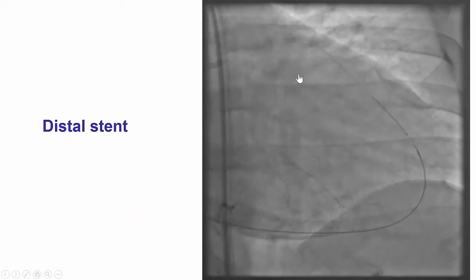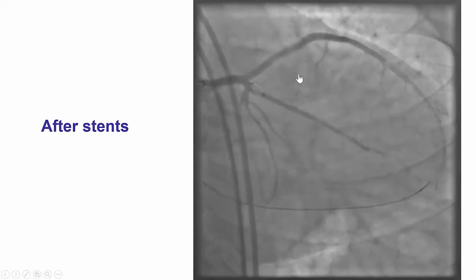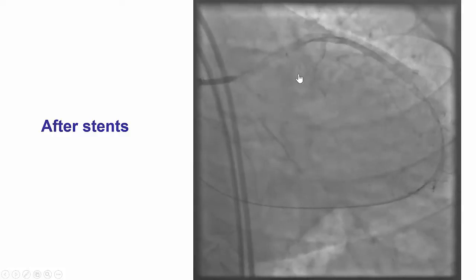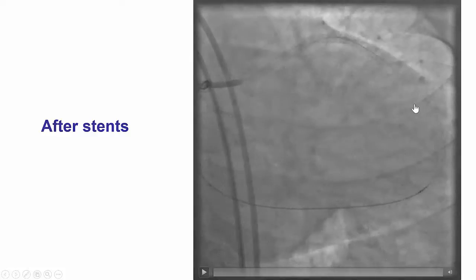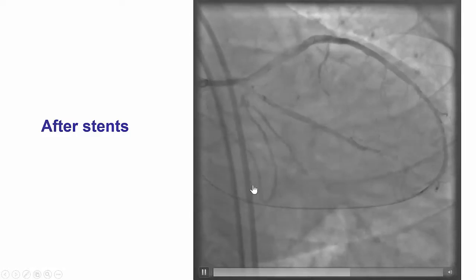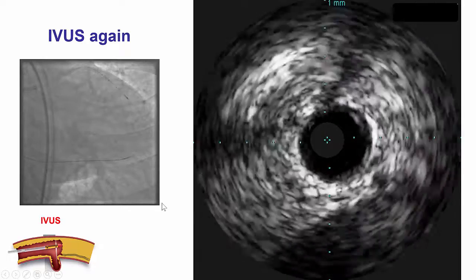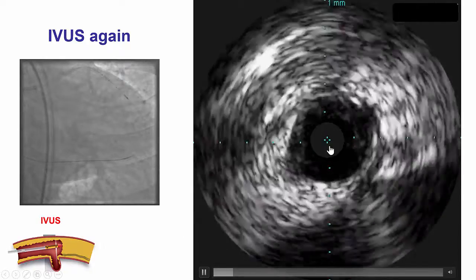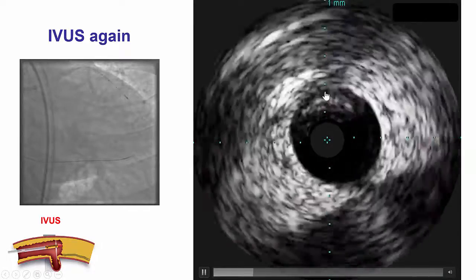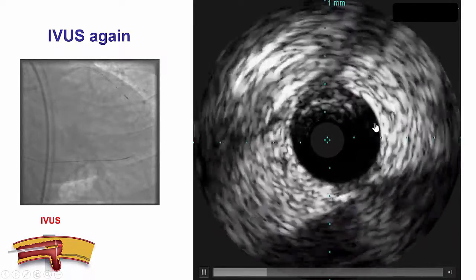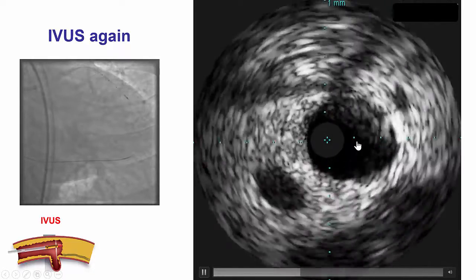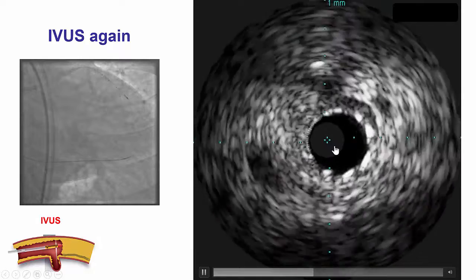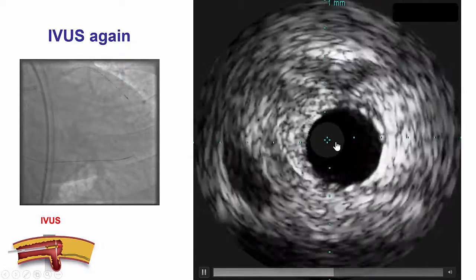After doing that, we performed stenting within the previous stent segments and there was improvement in flow. However, the distal part of the occlusion distal to the stent looked a little hazy. Repeat intravascular ultrasound demonstrated some dissection distally — a dissection plane with the true lumen on top being fairly compressed — so our stents had not covered the entire dissection plane.